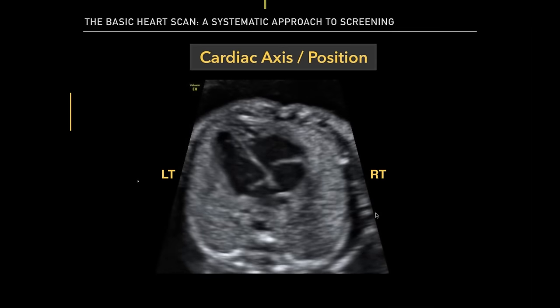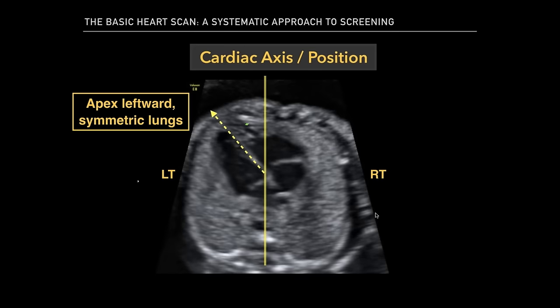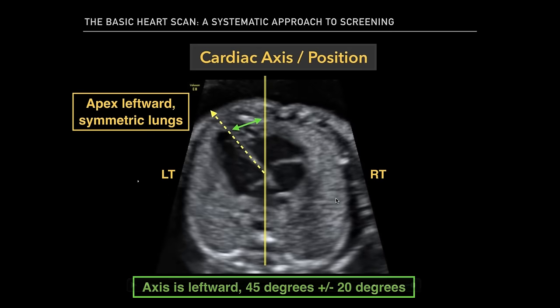Now, when evaluating cardiac axis and position, you want to draw a line down the middle, traversing through the right ventricle. The majority of the heart is on the left side, with the apex leftward and symmetrical lungs. Now, the normal axis is 45 degrees plus or minus 20 degrees.